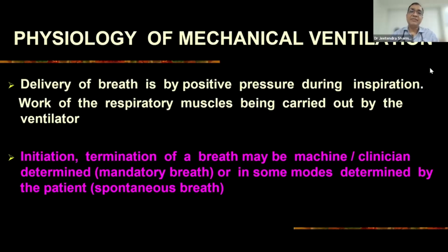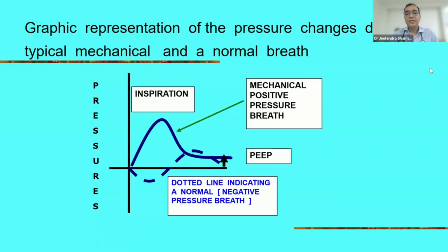Now this machine has classical steps, or rather phases. A common one is the initiation and termination of breath by the machine, and in some modes it is determined by the patient himself. So that is a major foundation of mechanical ventilation.